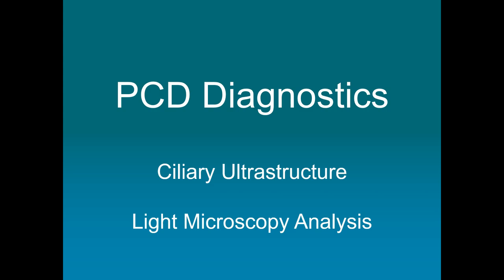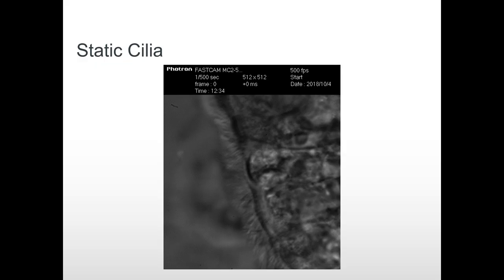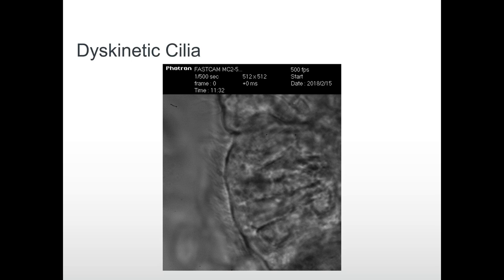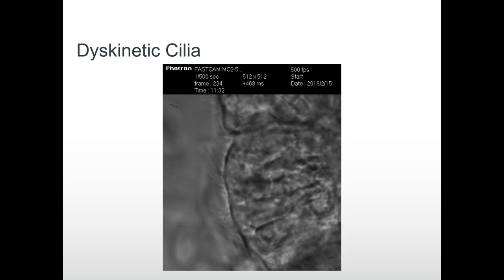Focusing on light microscopy analysis: light microscopy can be performed on live cells straight from the biopsy, using a microscope with a high-speed video camera attachment. Here we have some epithelial cells with cilia lining the edge, and here are some static cilia — I'm playing the video but you can see they're not actually moving. Therefore, we would get a buildup of mucus with tiny little particles that just wouldn't move anywhere, indicating this patient probably has something defective about the inner, outer, or both dynein arms. Here we also have some dyskinetic cilia — these are cilia that are moving but not in unison with one another, and not performing a full sweep, so the particles on the left-hand side are not really moving anywhere at all.